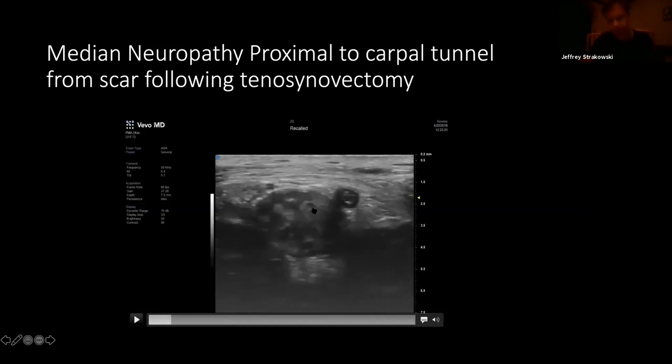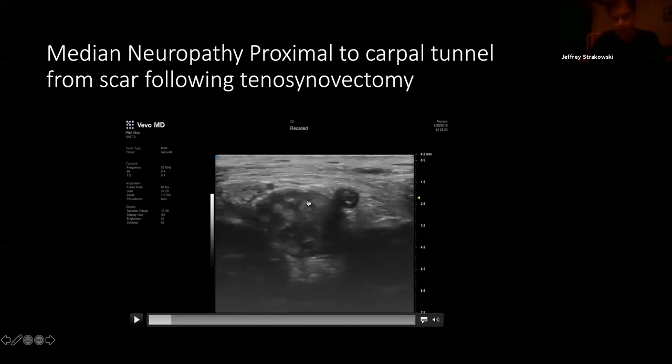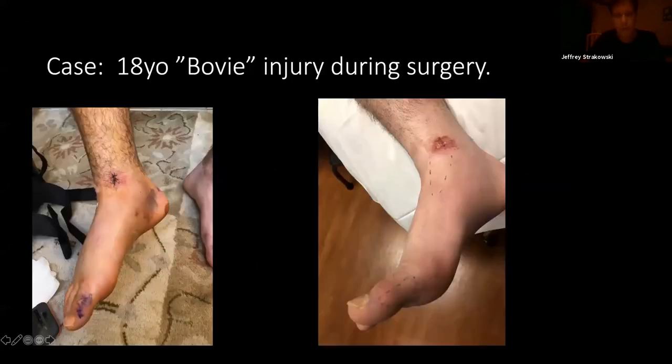And by distinguishing that with ultrasound, that puts the location of the injury in a different place than we expected. And certainly our treatment, if we were in the wrong place, wouldn't be effective. So we knew right where to decompress this area. Okay. Long axis. Here is just another thing that can help you sometimes in things you can't necessarily identify electrophysiologically.